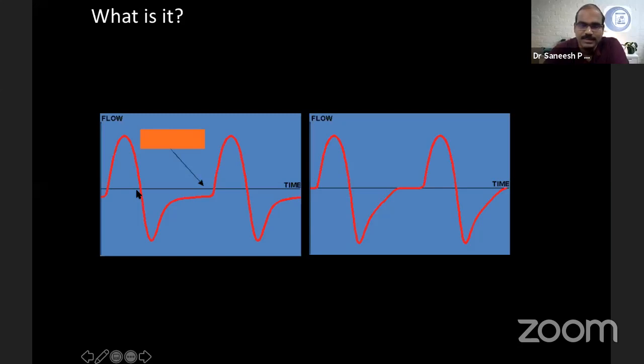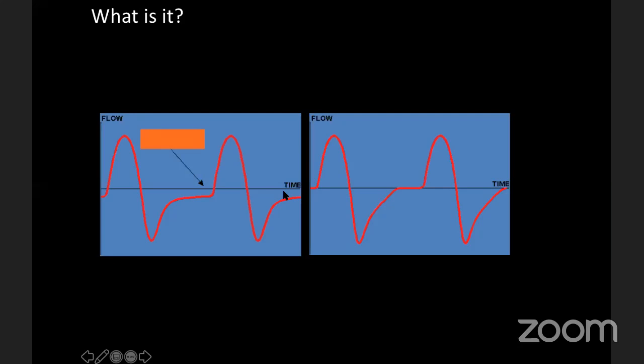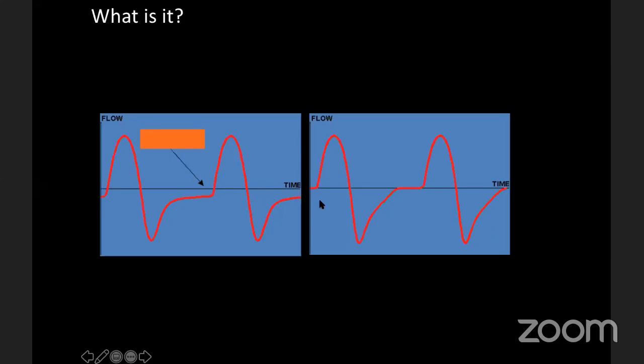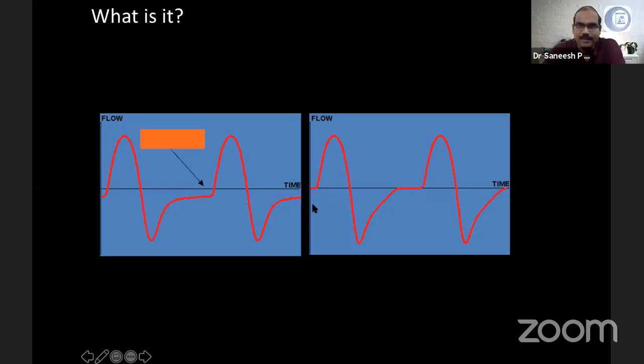So this flow versus time scalar, what can you pick up now? You can see one breath, because as Sir has mentioned, there is a positive swing and a negative swing. The positive swing happens in one direction, and exhalation happens in the opposite direction. That's why it's plotted on the negative side. What can you identify in this graphic? Auto-PEEP, sir. Okay, Dr. Shweta. Why do you say it's auto-PEEP? It doesn't reach the baseline, sir. Okay, basically there is air trapping.